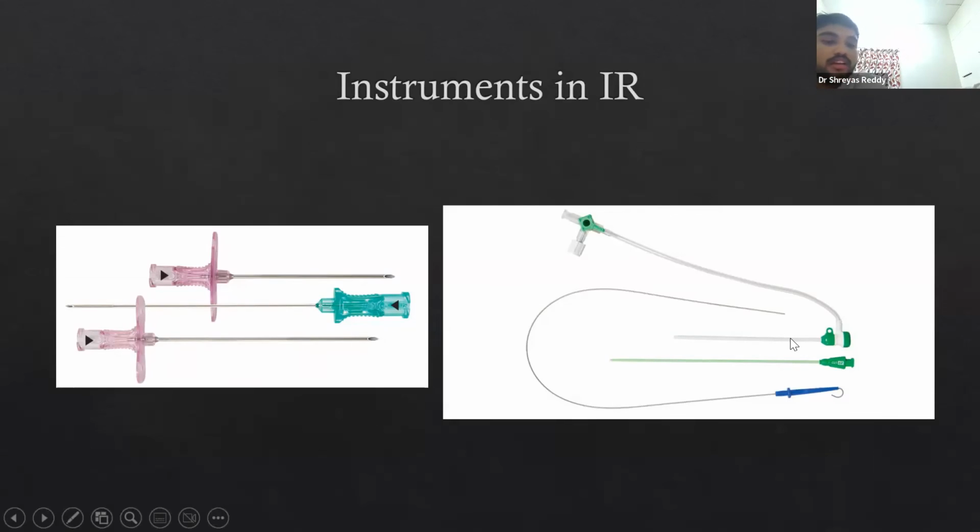Yeah. So, generally, what are the types of needle you know? Do you know of any needles other than this? There are two types of needle. One is the direct puncture needle, and one is the Seldinger type, where you do a double wall puncture and withdraw the needle. This is a single puncture needle, which we are very routinely using. So what is the technique used for getting a vascular access? Seldinger technique. But we are using a modified Seldinger technique to obtain vascular access.